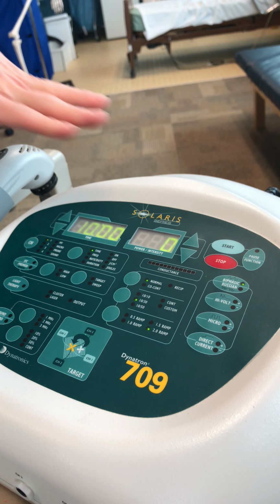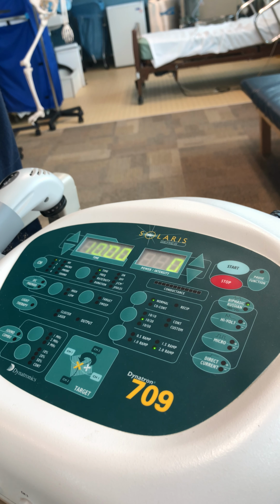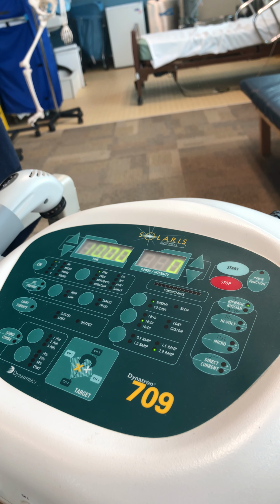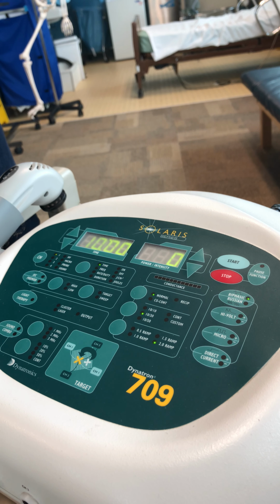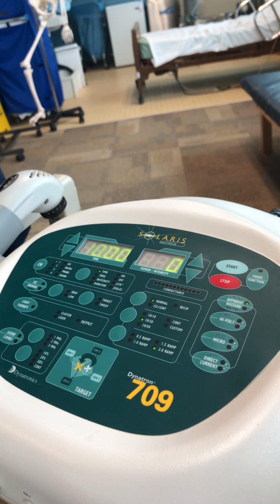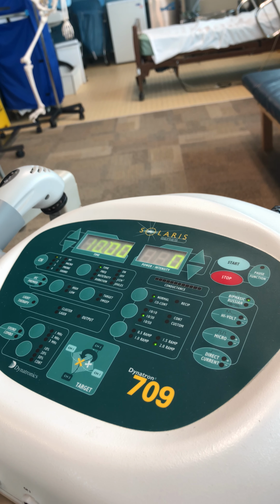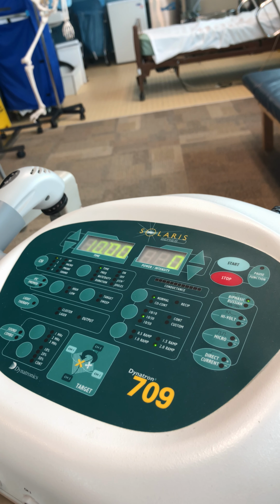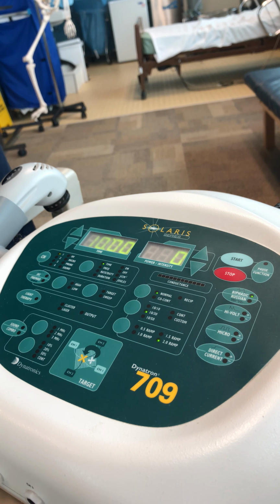Alyssa, we're going to do something called biphasic muscle stimulation to your right biceps to increase strength, right? It would increase circulation. Maybe if we increase strength, it'll help with range of motion, and definitely going to help with function. Contraindications: do you have any history of unstable cardiac arrhythmias like abnormal heartbeats? History of seizures? Pacemaker? Okay, there's a whole other list of them.